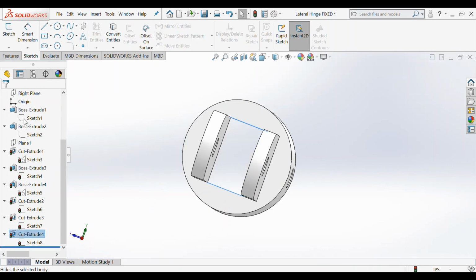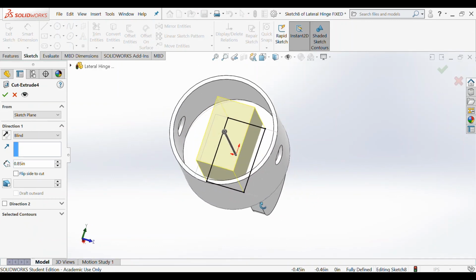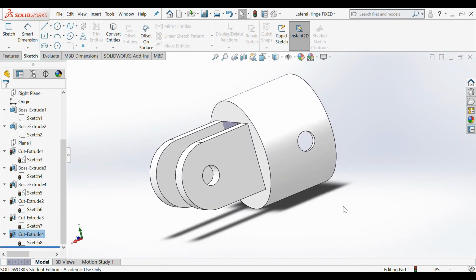And finally, we will use cut extrude and blindly cut all the way through 0.85 inches. And this creates our lateral hinge piece.